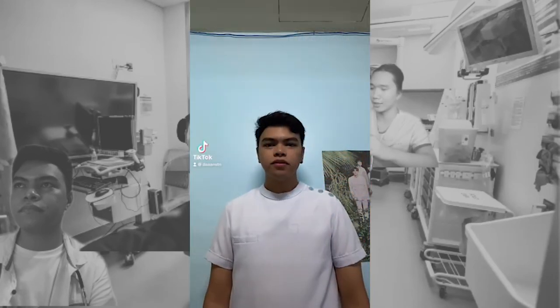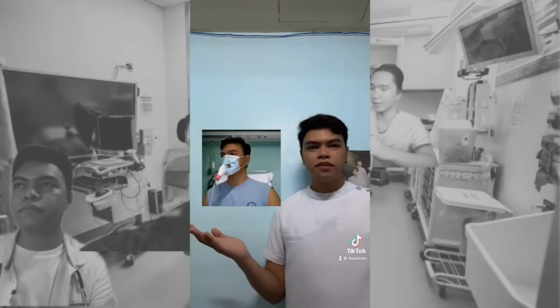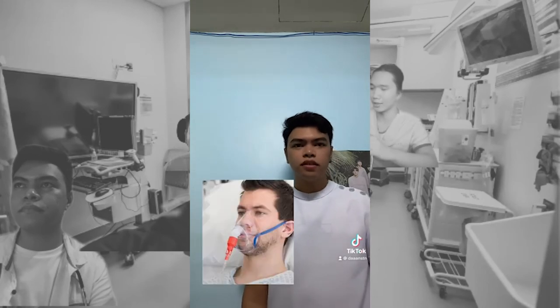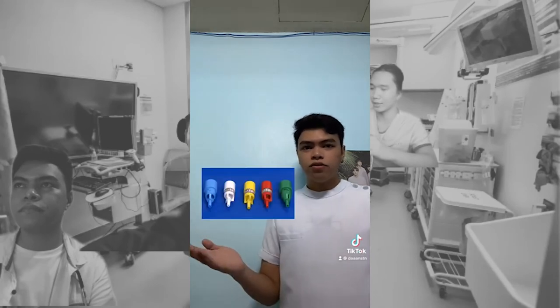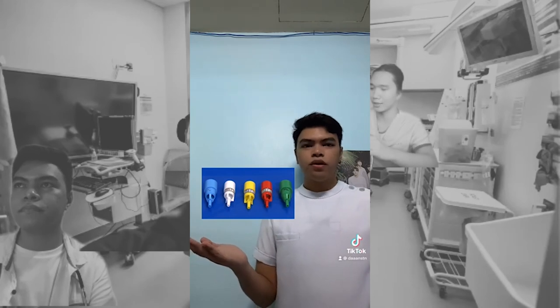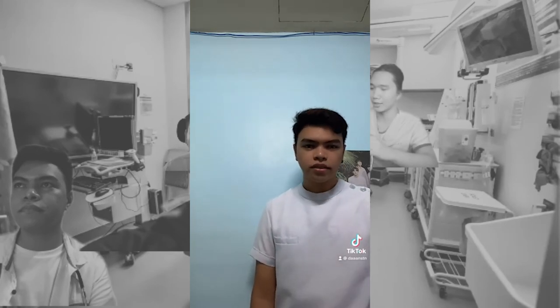The third method to deliver oxygen is through a Venturi face mask. It is used when a specific concentration of oxygen is to be delivered and/or when the patient continues to deteriorate. This uses special adapters that vary in diameter flow in order to achieve a specific FiO2. They range from 24 to 60% and are of different colors.